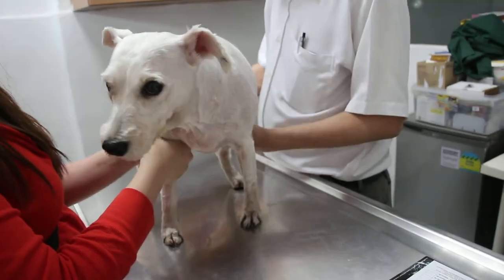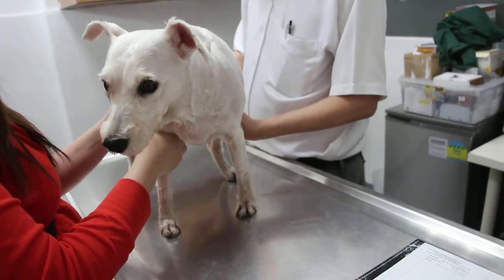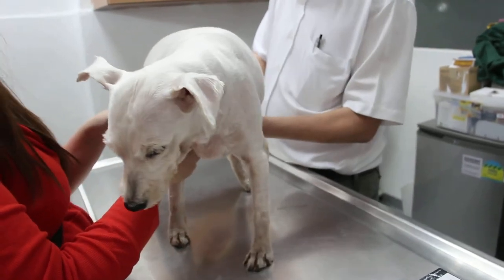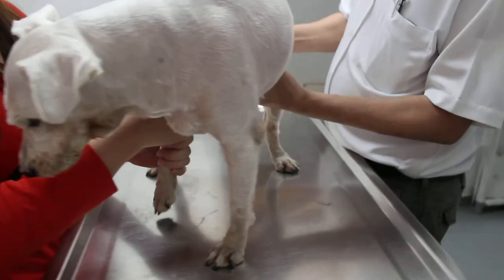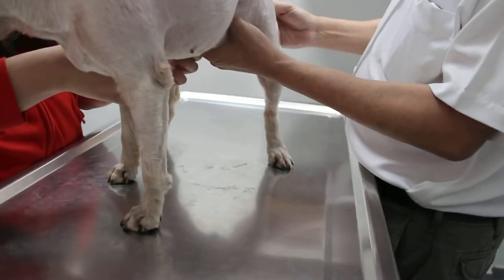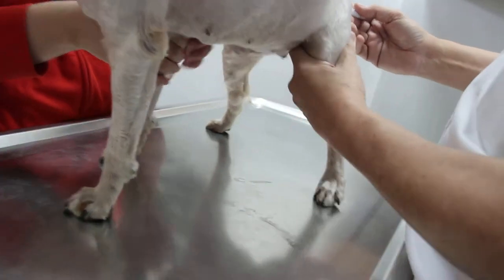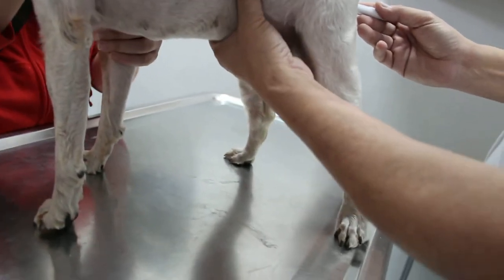The surgery will be done in the afternoon by Dr. Daniel. Now I take the temperature and then I feel the bladder. I just check — and Dr. Daniel will just show that.